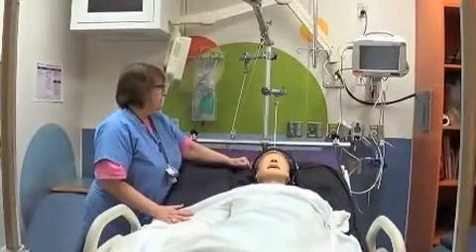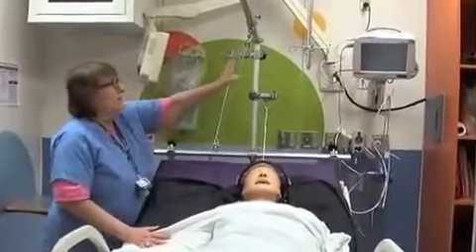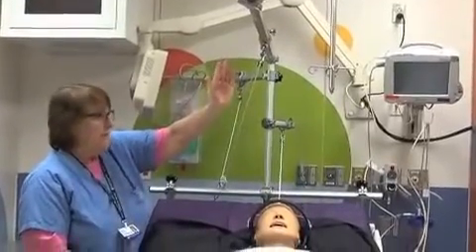The things to look for are that the cords are running free — they're not touching anything. These cords are for a separate setup, which is for when they're sitting straight up.